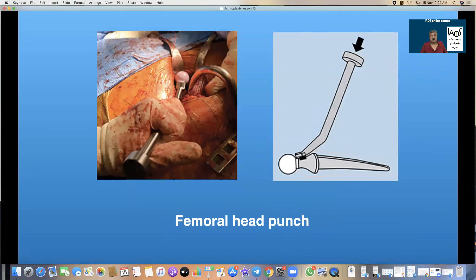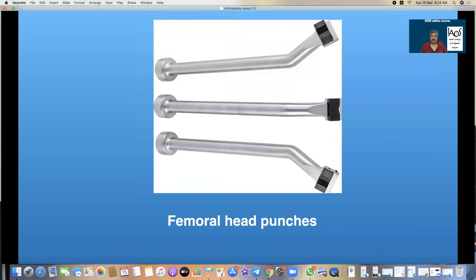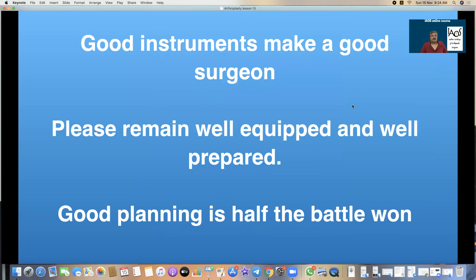That is a femoral head punch, and the one on the right is a modified punch used to take the head away from the stem. These various femoral head punches always have a Teflon tape and a carbon fiber element to ensure that as you tap you do not scratch or damage the femoral head.